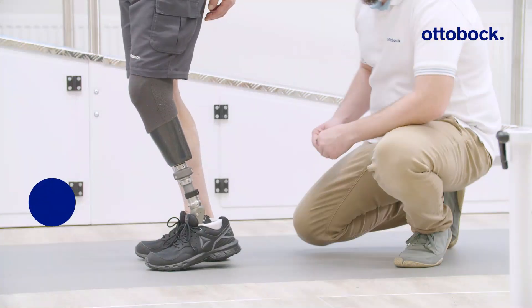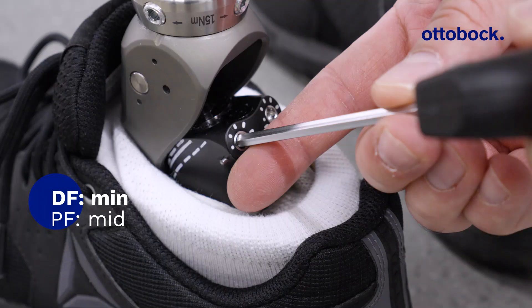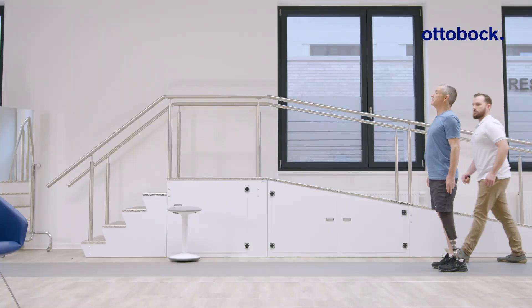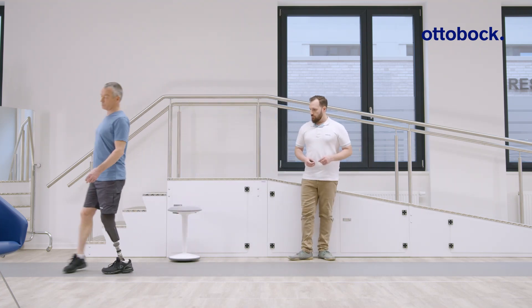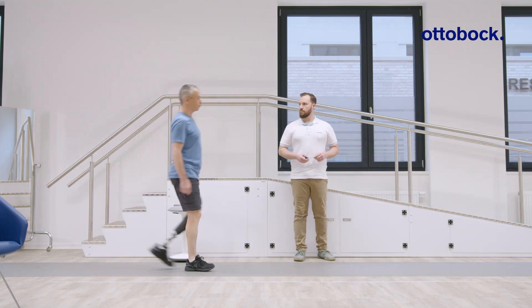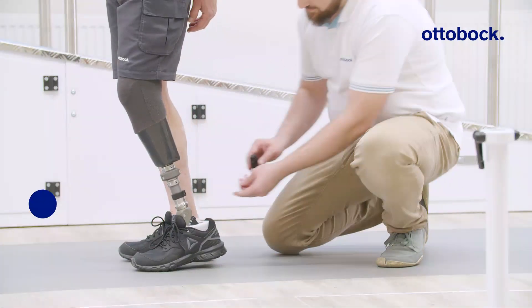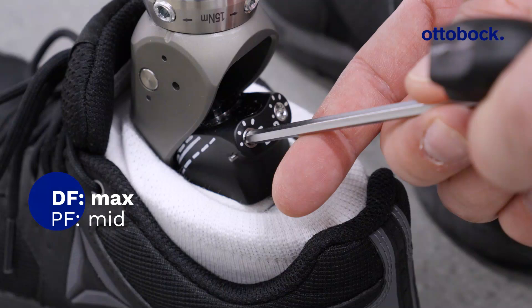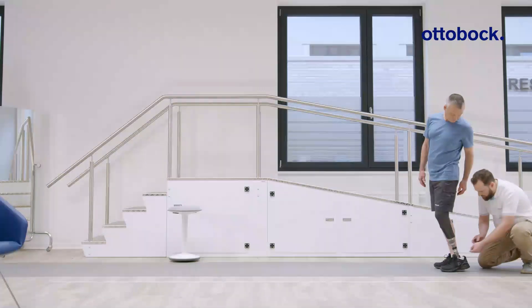Setting the dorsiflexion resistance to minimum will lead to a very quick transition to the dorsiflexion stop that can be felt by the user. By comparison, setting the dorsiflexion resistance to maximum results in a feeling of walking uphill.